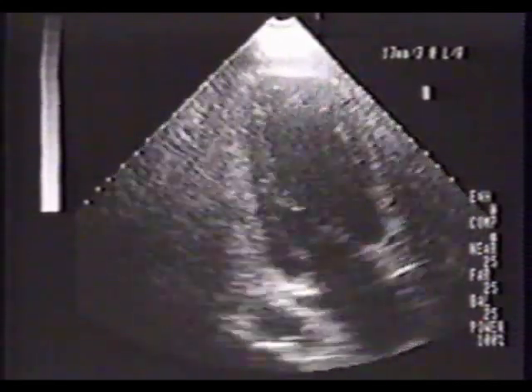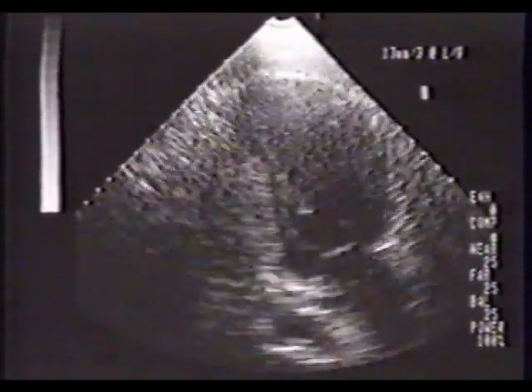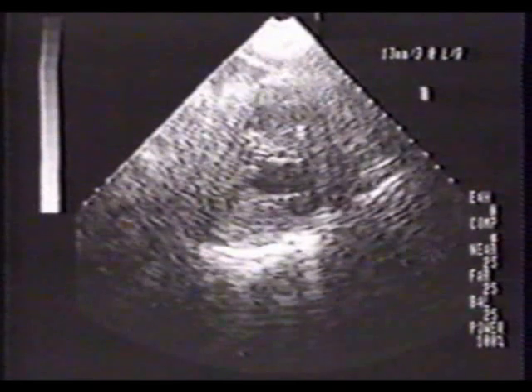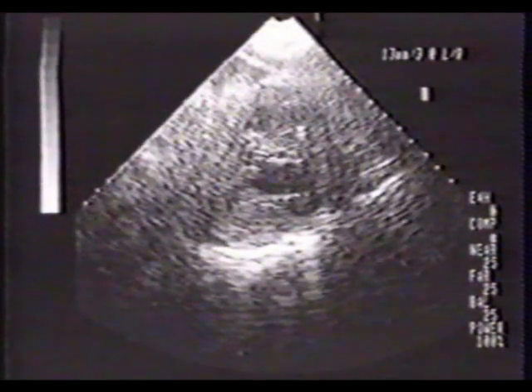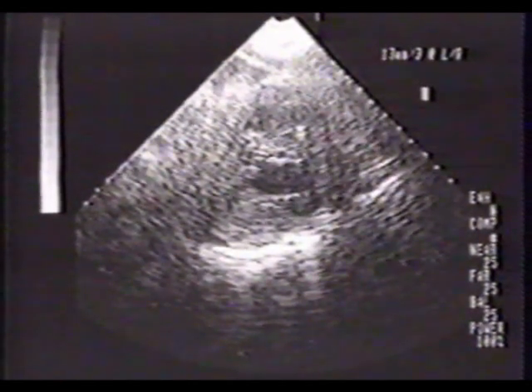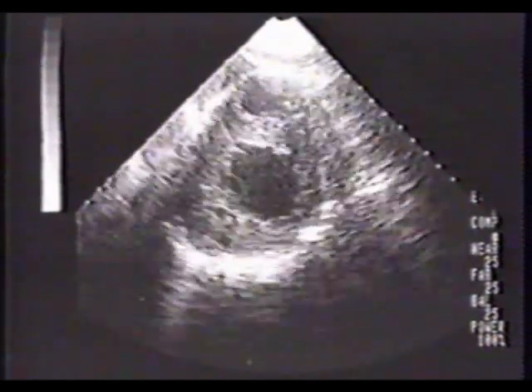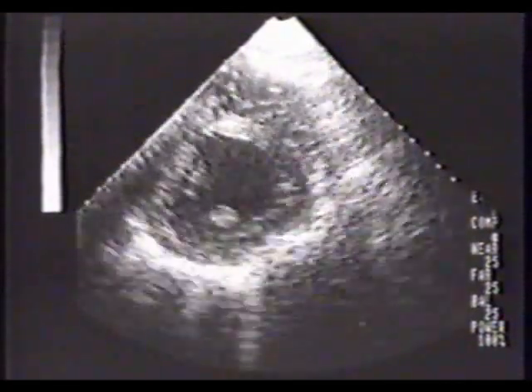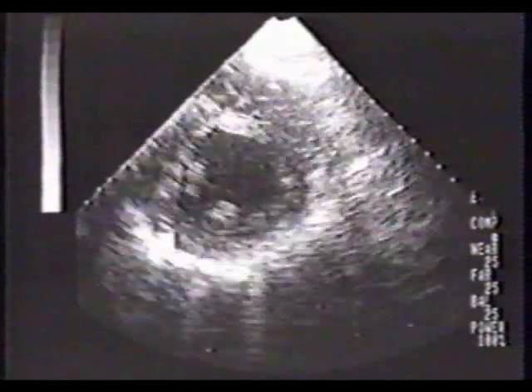The apical two-chamber view also reveals very minimal contractility. He unfortunately presented prior to the advent of acute interventional therapy and died despite vigorous support within several hours of admission. The severe acute reduction in left ventricular function is underscored by this subcostal short axis scan from apex to base. The only wall with normal contractility is the lateral.